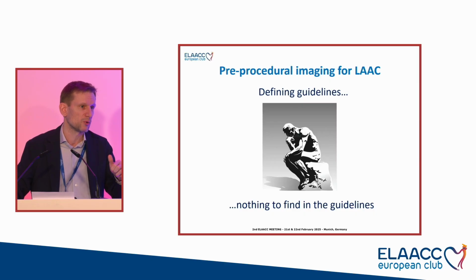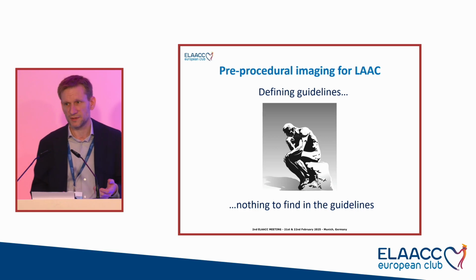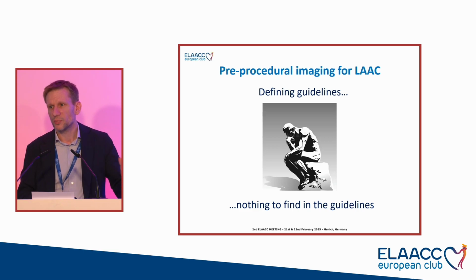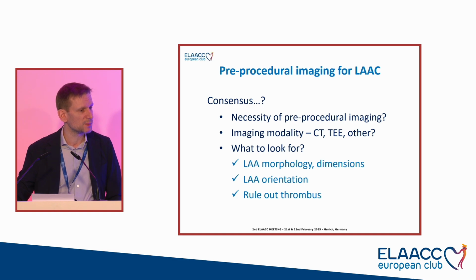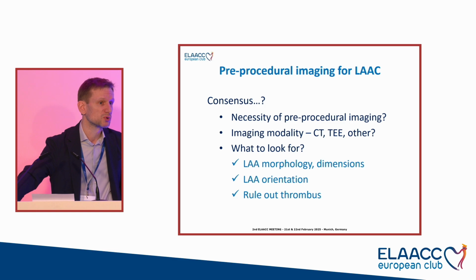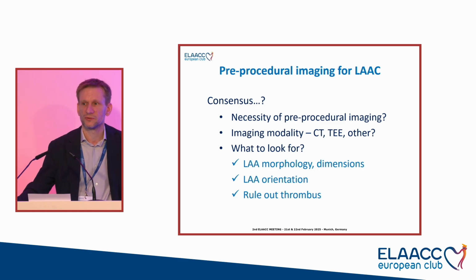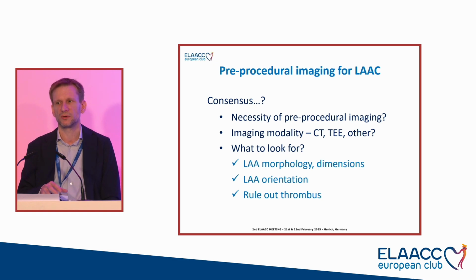Very often they already open up for TE or CT, and they say you have to rule out thrombus. And typically they say you have to size, but they don't specify how. So it's too minimal what they come up with as a consensus or recommendation in the studies, I think. So the necessity of pre-procedural planning, imaging modality, what would it be? The point I wanted to make is, as 90% of people in the world still use TEE during their procedure, I don't fully get what you get.